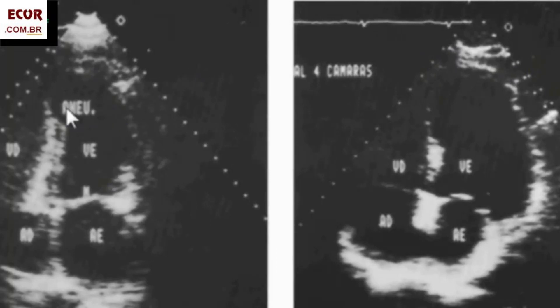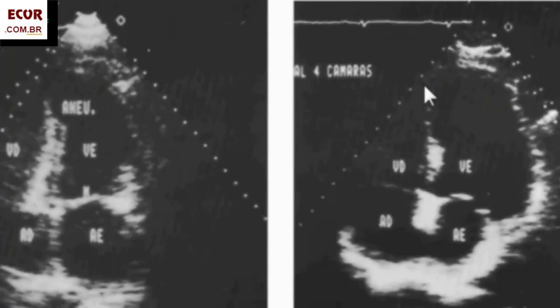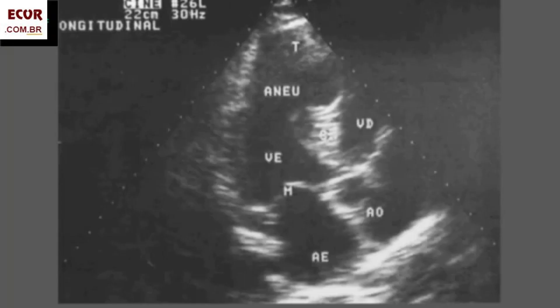The presence of a thin and dyskinetic wall means it's really fibrotic. So just to remind: for an aneurysm, we have to have dilation, fibrosis, a wall that is dyskinetic. And it is very important that we can find the neck part where the thickened area becomes thin.